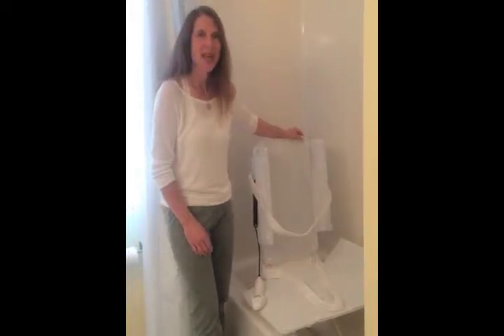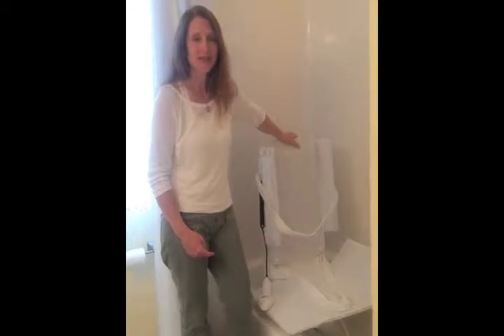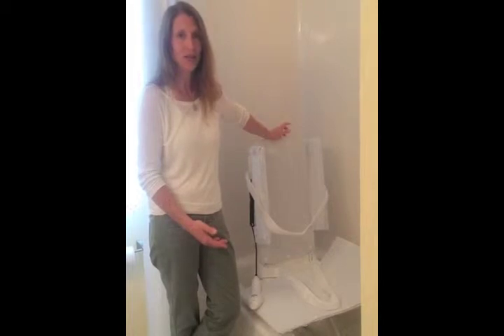This is Karen Cook from Functional Homes, and I just want to introduce you to the bath lift. What I like about bath lifts is it gives you access to the bathtub without putting in a big, fat walk-in tub.